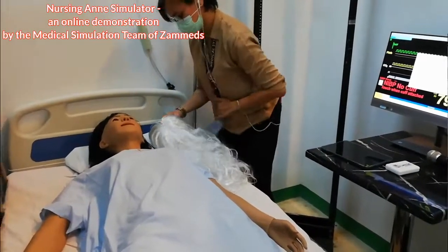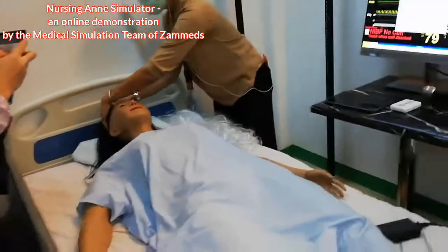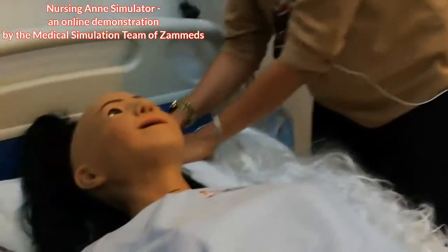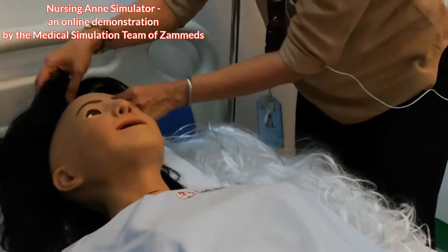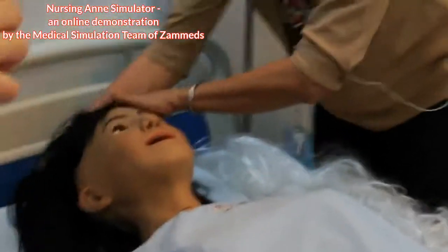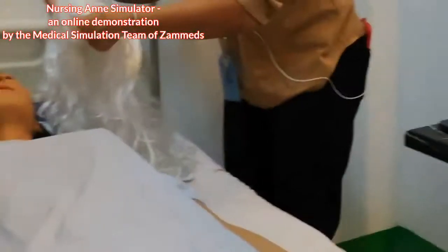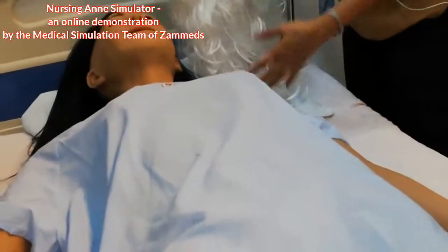As you saw in the video earlier, the wig or hair of our nursing aunt can be interchangeable. It can be black, like what we currently have on, or there is a second option in white. There is also an option for blonde hair.